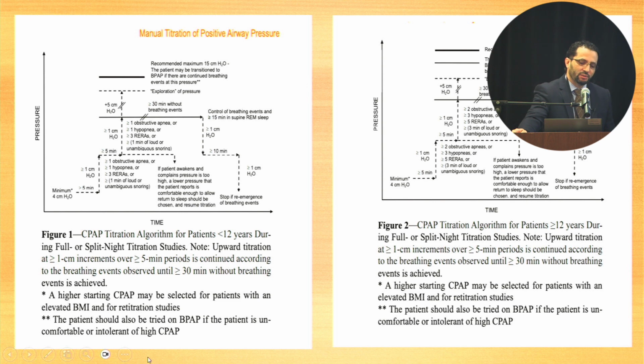And you continue for 30 minutes, and either you eliminate your respiratory events, or you reach the maximum pressure allowed to use for those patients. Because after that, pressure of 15 centimeters of water for children, and 20 centimeters of water for adults, then we start thinking about barotrauma and the pressure-induced injuries to the airways and to the lungs.